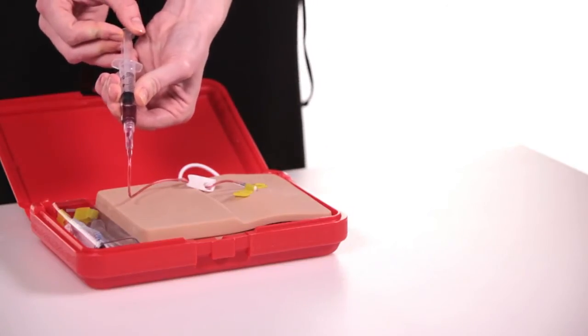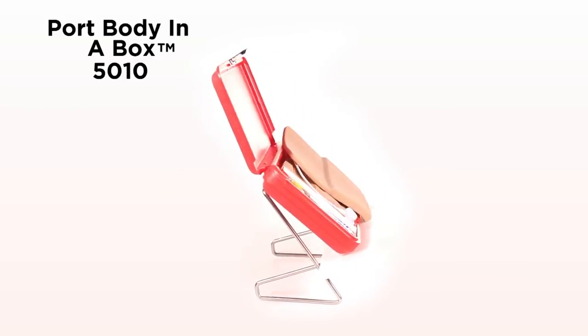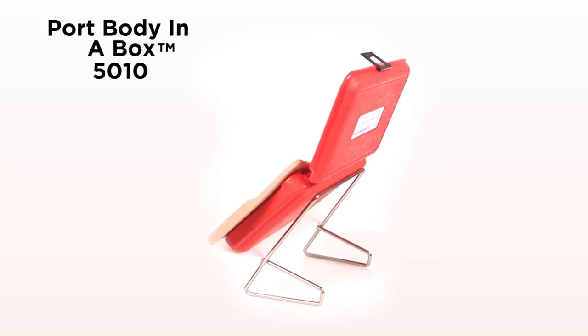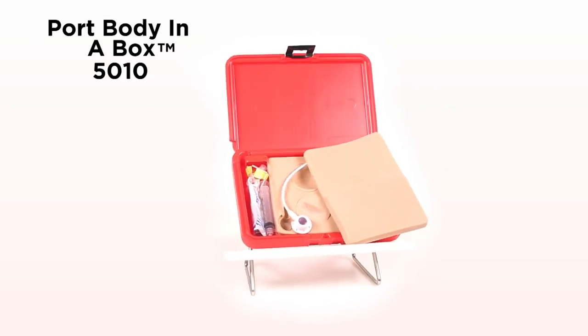Refilling the bag is done with a Huber needle through the septum in the port. This is a great cost-effective model for hands-on practice to build confidence and experience in the practice of palpating and accessing ports, which can be easily transferred to direct patient care.